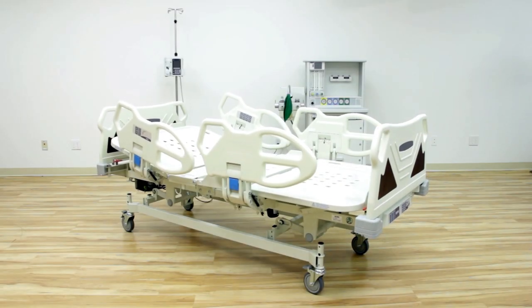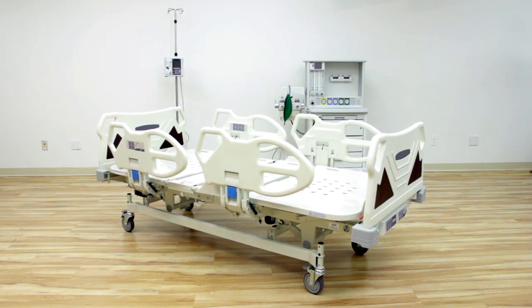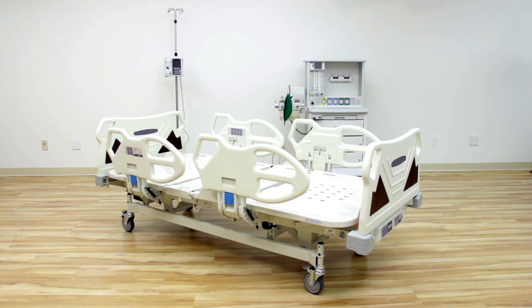In the event of an emergency, caregivers can utilize the Premio's automatic CPR button to flatten and lower the patient to begin administering CPR or other critical, life-saving maneuvers.